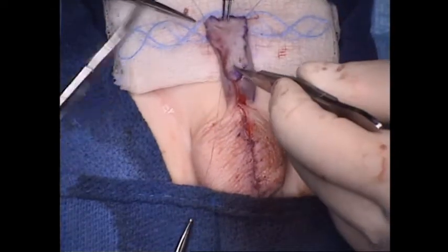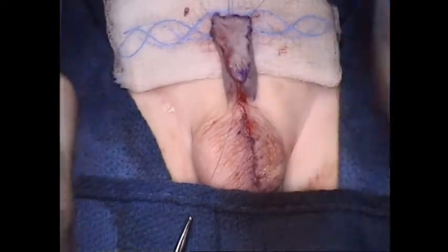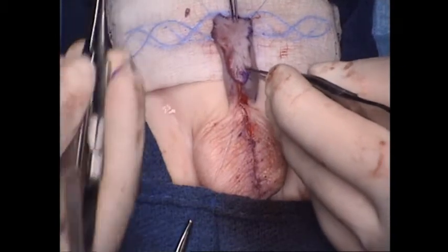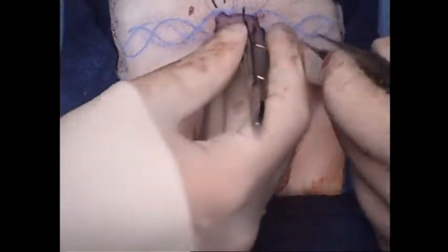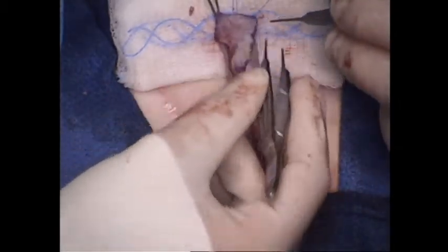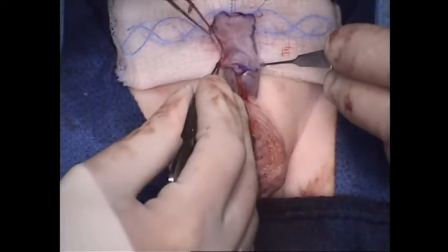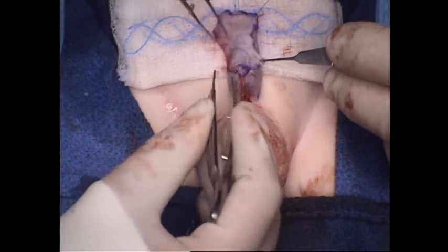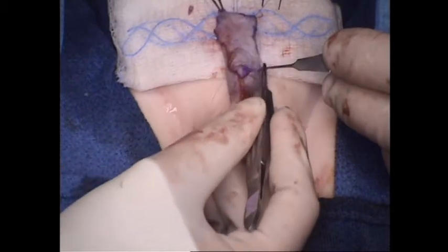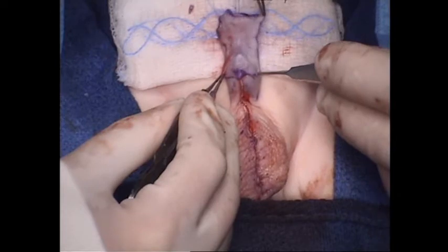Too wide. Yeah, so again, we have more graft than we need, and we just have to take a moment and trim it in the optimal way. Obviously, we want no tension on the graft. Grafts want to shrink a little bit, and so we don't want to put it down tight at all. Hold here. So in essence, the edges of our graft are going to come straight down from the corona. We kind of want a nice rectangle of a graft, so that's what we're planning on.